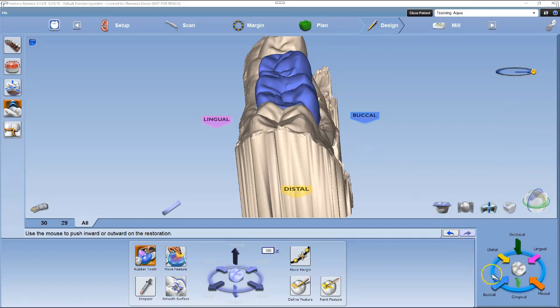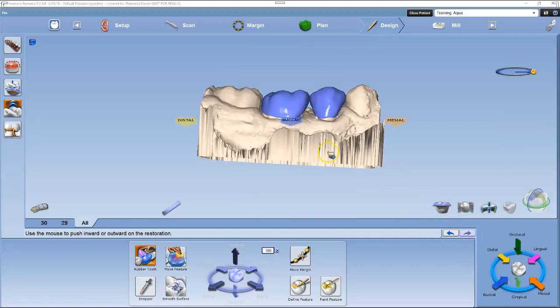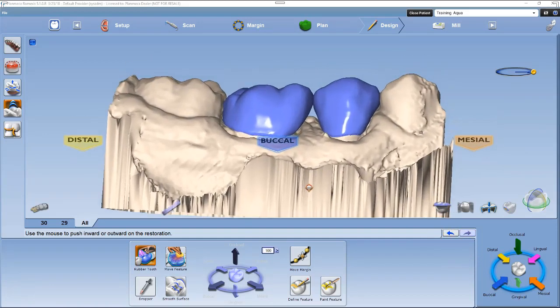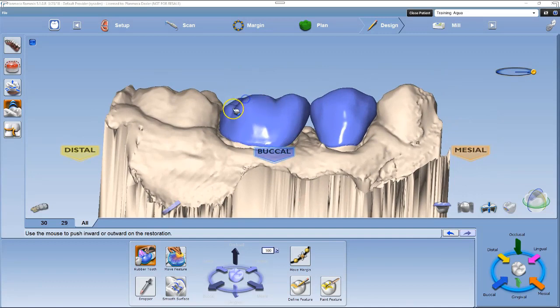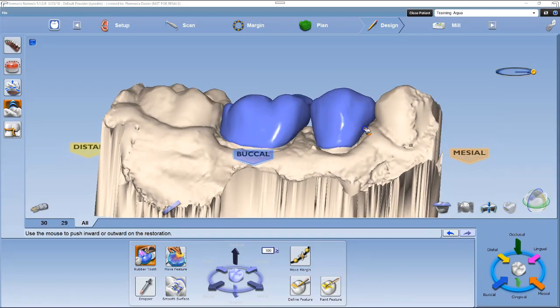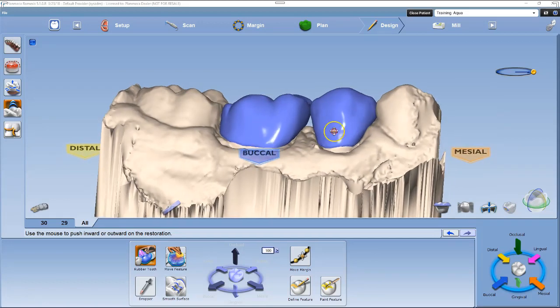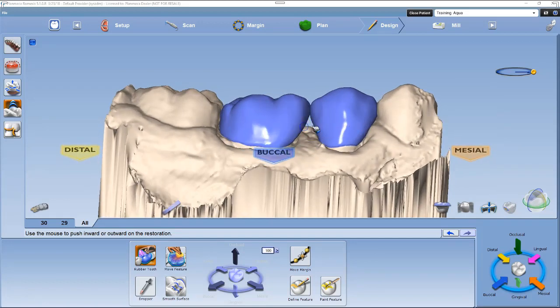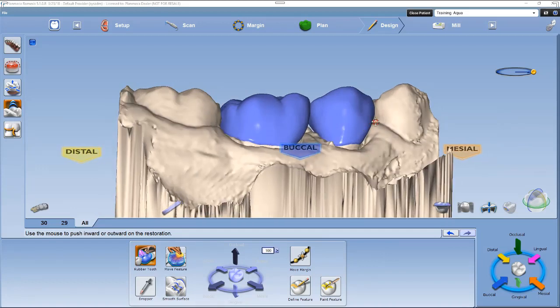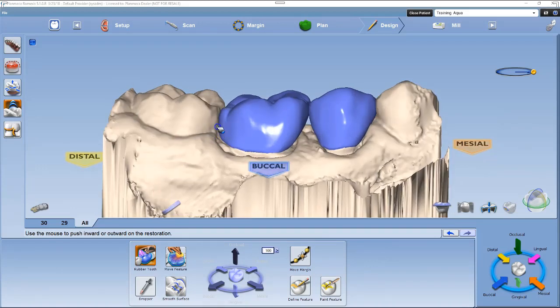The fourth step: left-click the buccal arrow in the quick view circle. In the buccal view, evaluate cusp tips and adjust them to the same height as the neighbors. Next, evaluate the concavities near the gum line and adjust to remove those concavities.